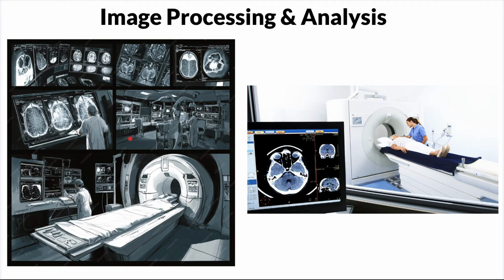And we remember yesterday we saw the difference between machine learning and deep learning. With machine learning, the feature extraction you have to do yourself as the programmer, but deep learning is able to extract the features on its own, right? But remember, the accuracy of your model depends on the quality of the data set you feed to the model.